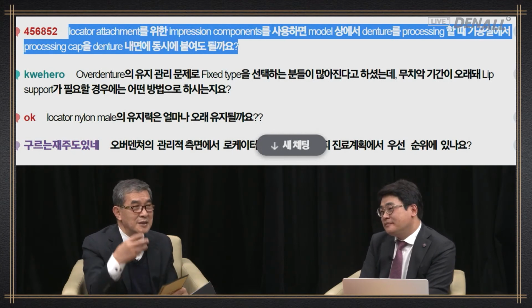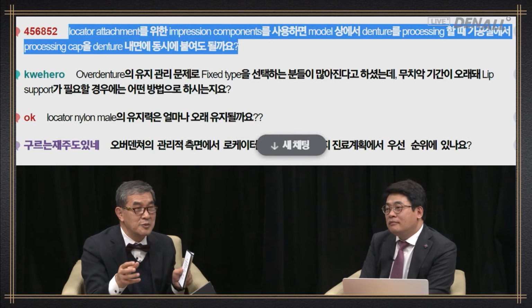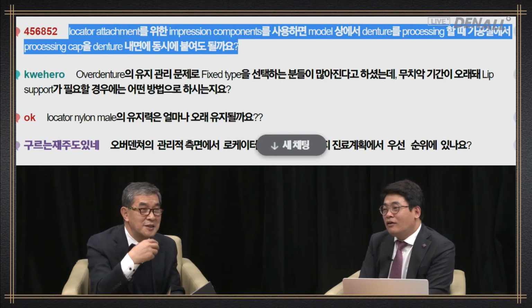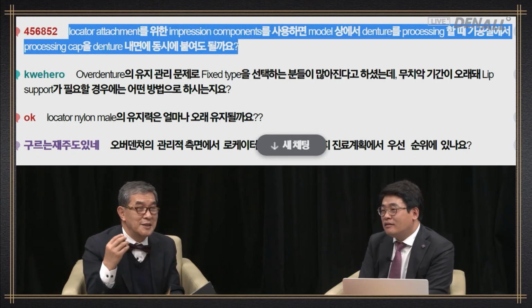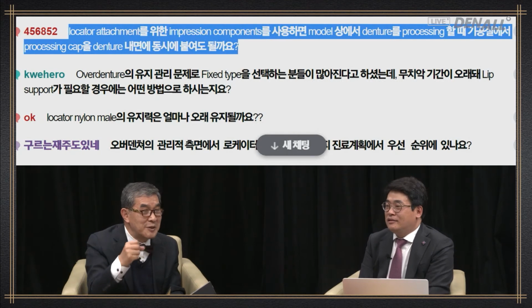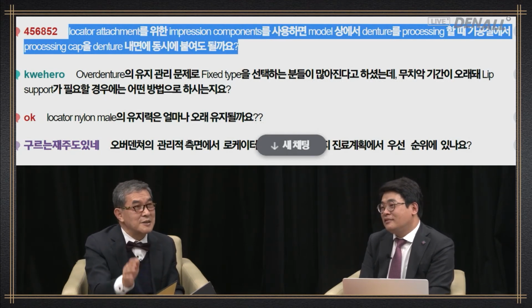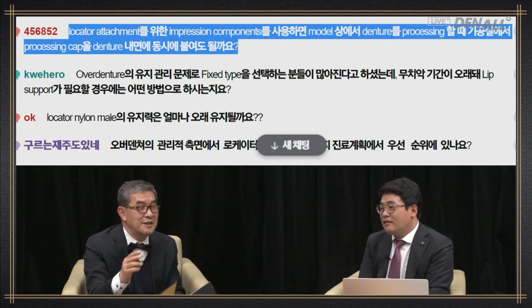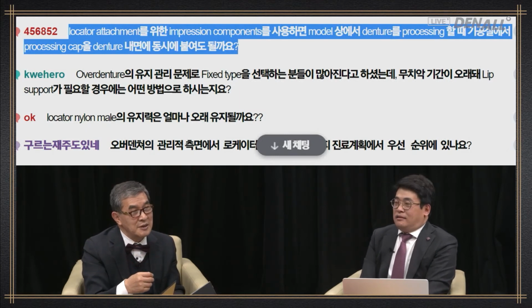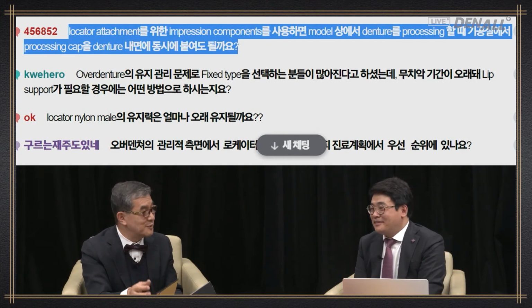One time, I placed 4 implants. I want to share a story where I really fell in the lurch. These days, I normally attach 1 at a time, but at the time, I did 4 all at the same time and it did not fall out. It was as if I met my nemesis. I struggled immeasurably and felt the temptation to cut the denture. And that was my experience.